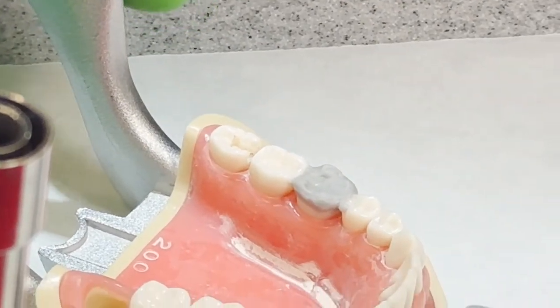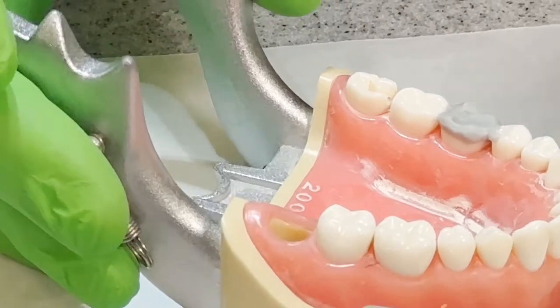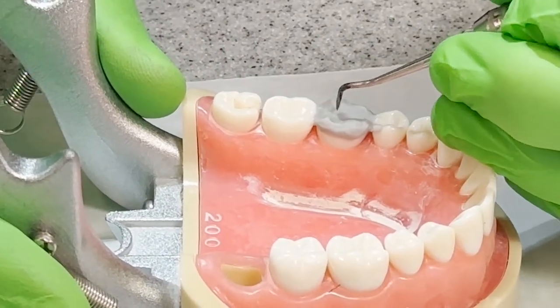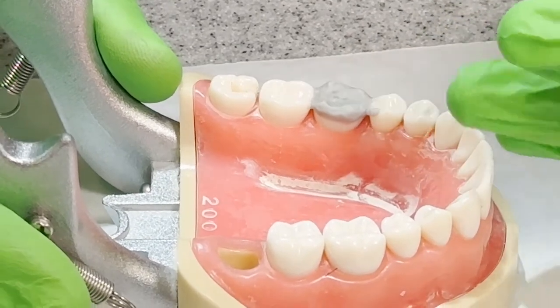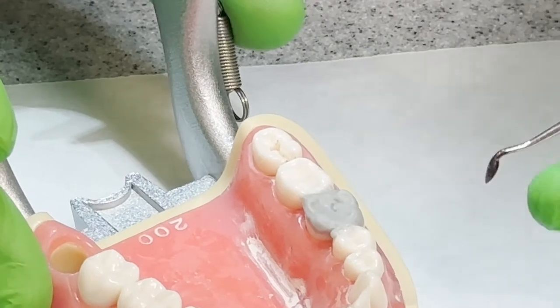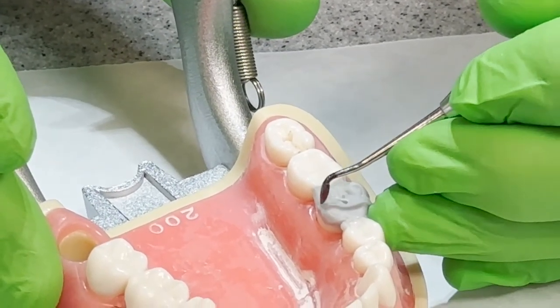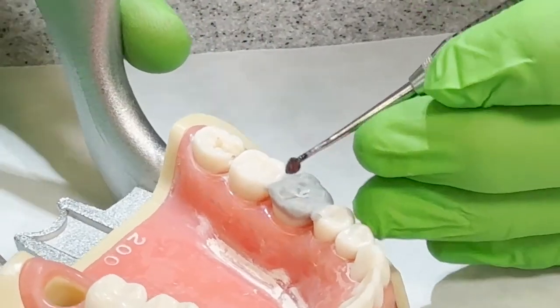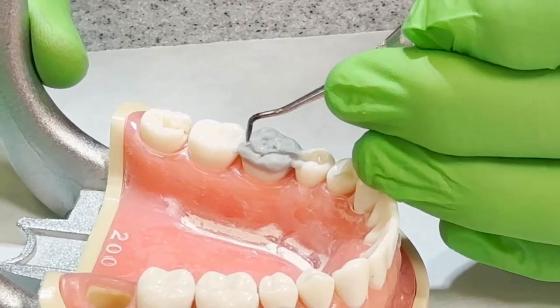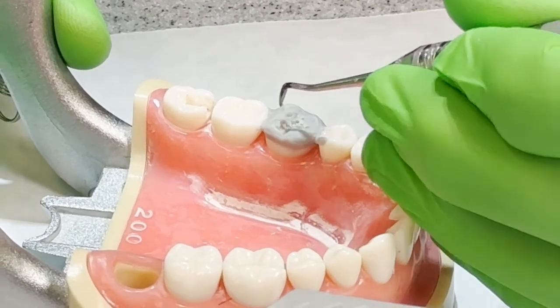Now I'm going to take my carvers and try to locate where my anatomy should be. I may have to end up doing this two or three times, I don't know, but we're going to try here. I know those lingual cusps are about equal in size, so I'm going to bring that lingual groove in, and try to make this look like a tooth.